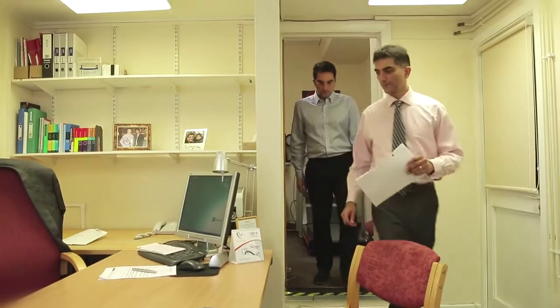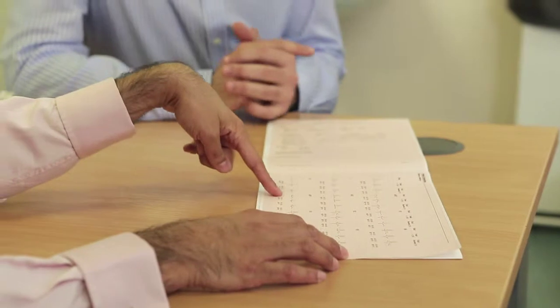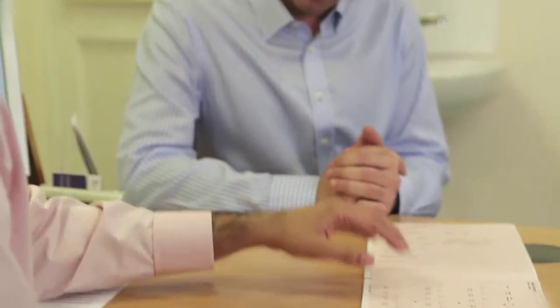We're also looking for any changes in the patient's blood pressure that might be inappropriate. We're looking for changes in the rhythm of the heart, and we're monitoring the heart constantly during the test. Apart from mechanical issues with the treadmill, the risks are very small. We monitor the patient's ECG and the blood pressure in their recovery phase, and the results are available immediately for interpretation.